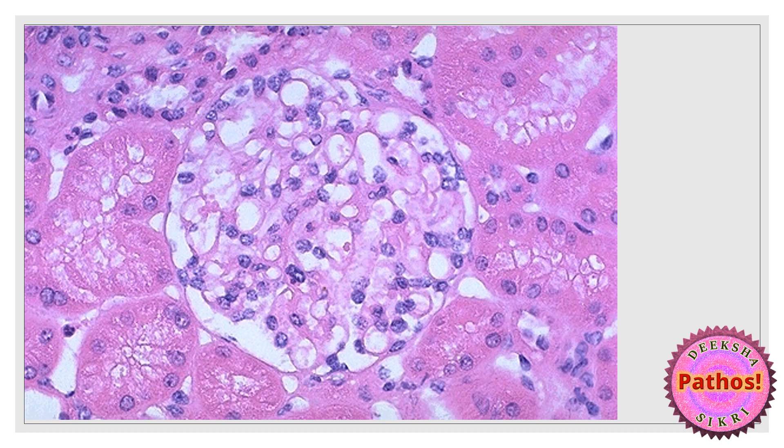This is a normal glomerulus surrounded by tubules. This is the Bowman's capsule — that circular structure. The empty circles you see in between are the capillary lumens, so every empty circle within the glomerulus is a capillary. The pink area with the gray arrow is the mesangium — break down the word: 'meso' means between, 'angium' means vessel. The blue nuclei in it are the mesangial cells.